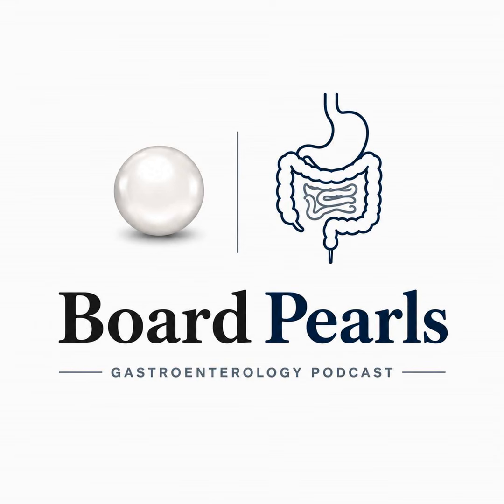A pancreatic duct stone larger than about 5 millimeters will not exit. The papillary opening after sphincterotomy is mechanically smaller than the stone, so the stone has to be fragmented before it can come out. The fragmentation tool of choice is extracorporeal shockwave lithotripsy, and the reasoning is access. ESWL breaks the stone with shockwaves delivered from outside the body, so it never has to get an instrument up the small, tortuous pancreatic duct to do its work. It achieves complete ductal clearance in roughly 70% of patients, and you then extract the fragments at a follow-up ERCP.